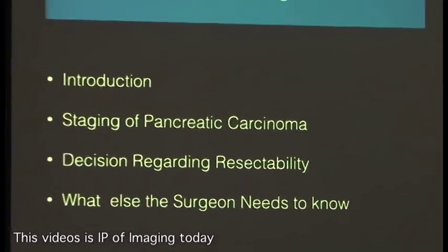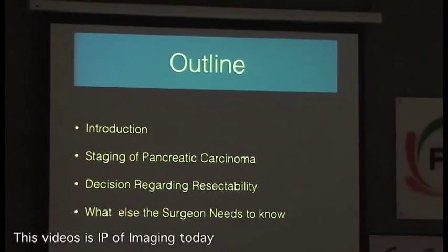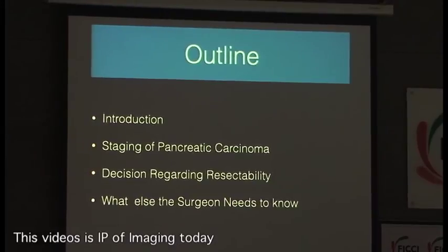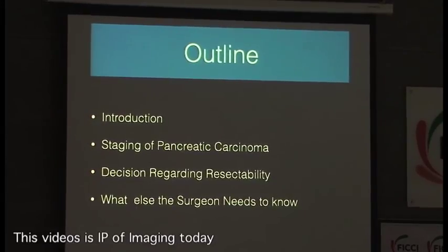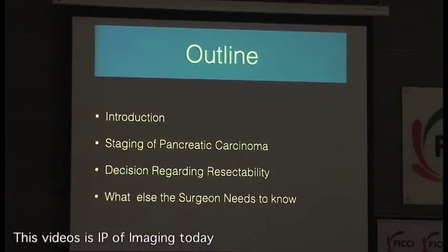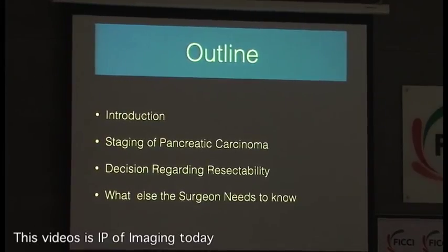Okay, so my lecture is going to go something like this. I'm just going to give you a short introduction and I'll tell you how to stage pancreatic carcinoma. Then I'll give you how you take a decision regarding resectability, which is what all surgeons get a scan done for. And I'll tell you some other things that the surgeon needs to know, which we can tell them and which can help both the surgeon as well as the patient.